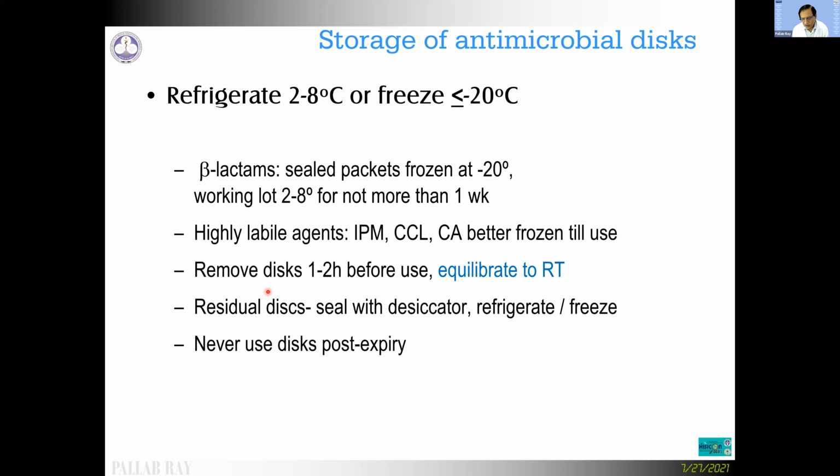It does not matter for the discs that you'll be using immediately. But if you leave the residual, say, 20 or 25 discs where moisture has deposited during storage, the antibiotic will lose potency. So residual discs should be sealed, ideally with a desiccator, and refrigerated or frozen. Never use discs post-expiry.